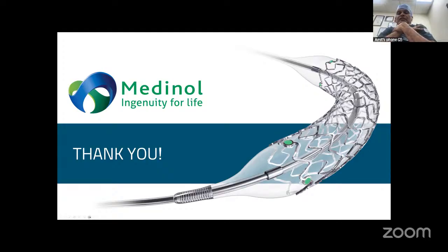So looking at the stent struts and everything, I feel that the eosinophilic reaction and everything is going to be less. I don't know how much the alternating strut thickness is going to matter in this case, but definitely it will be good to look at really long-term data. But 24-month data looks really promising in this case.